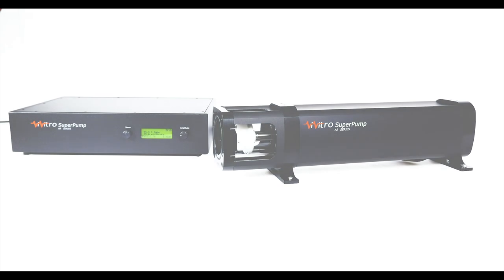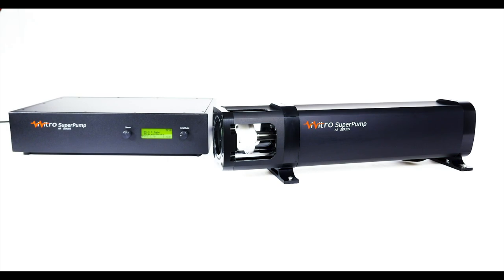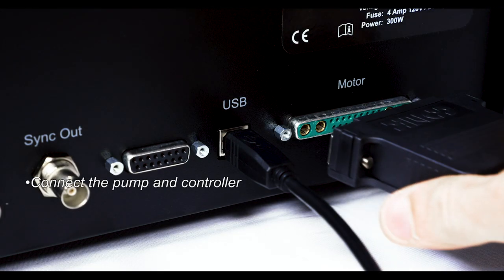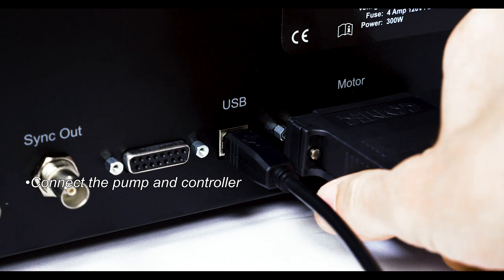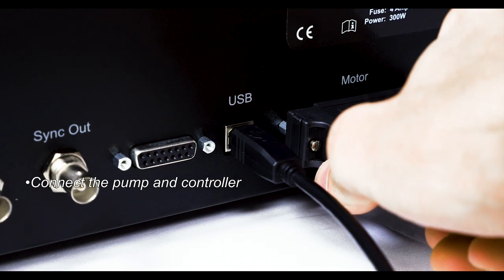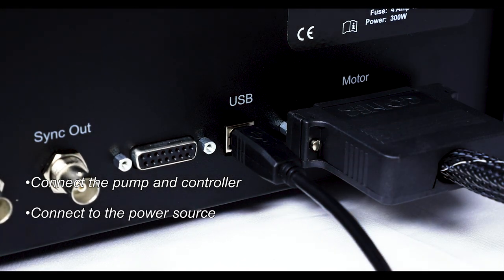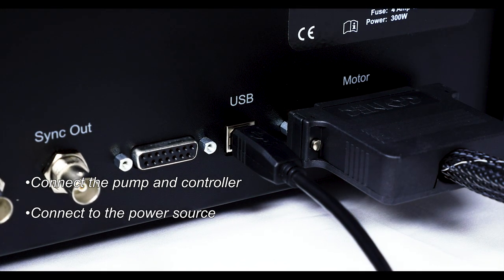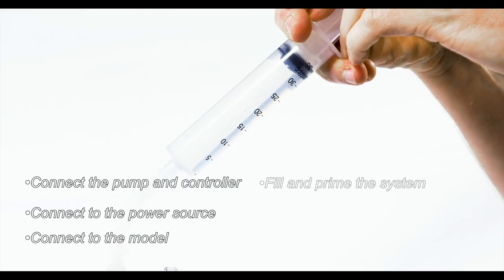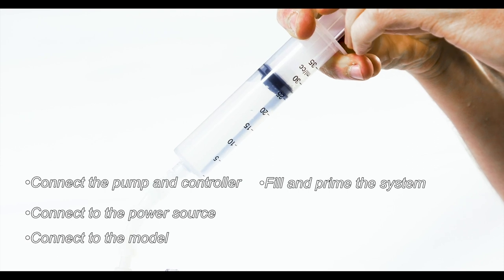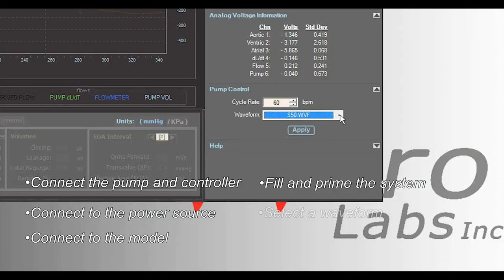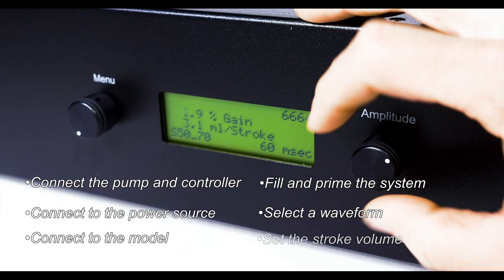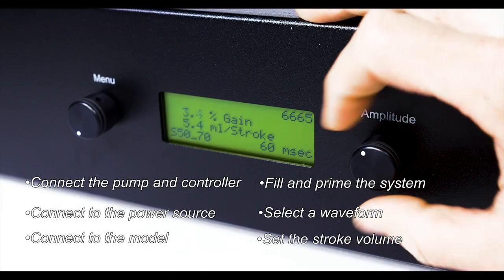The super pump is easy to install and commission. Connect the pump and controller. Connect to the power source. Connect to the model. Fill and prime the system. Select a waveform. Set the stroke volume.